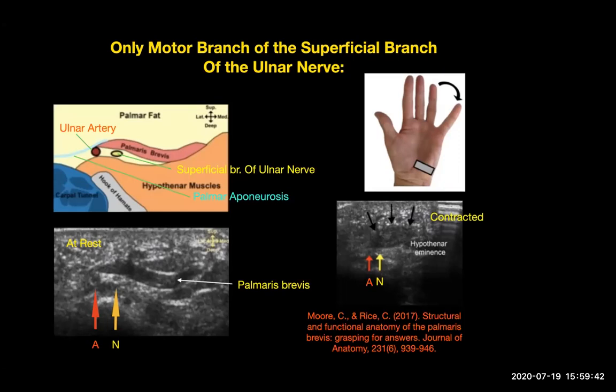So it's very interesting that this type of nerve could be sensory, but then there is a motor branch that is distal to that. And so as you can see here, there is a hypoechoic area. When you try to scan it, you can do a dynamic maneuver.